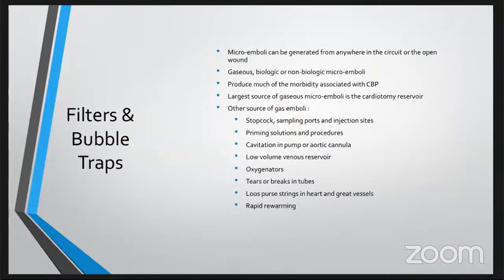Moving to the filter and bubble traps, microemboli can be generated from anywhere in the circuit or in the open wound. Gaseous or biologic or non-biologic microemboli might be generated. It produces much of the morbidity associated with cardiopulmonary bypass, and the largest source of gaseous microemboli is the cardiotomy reservoir.